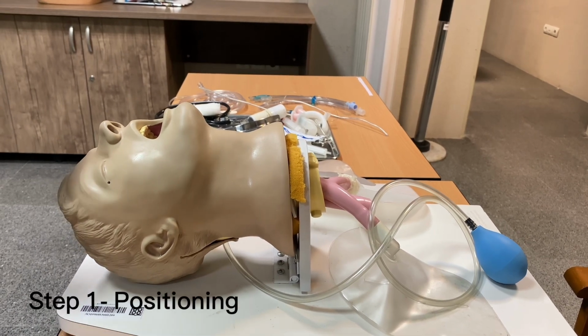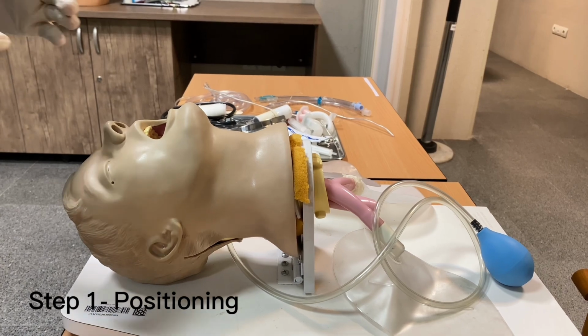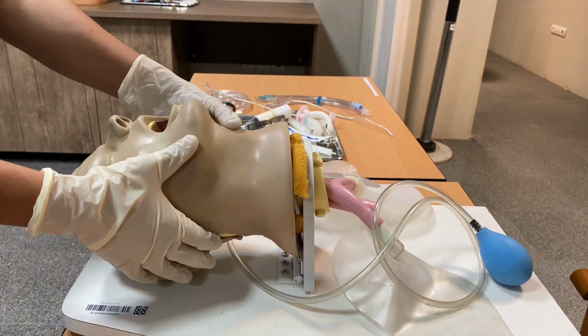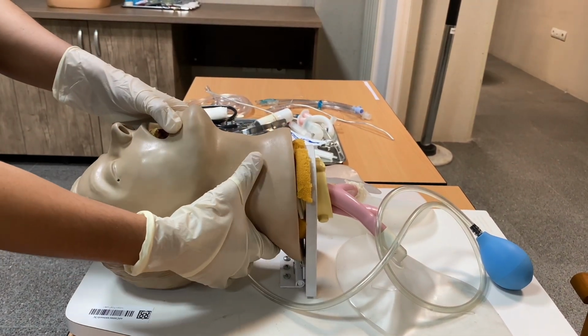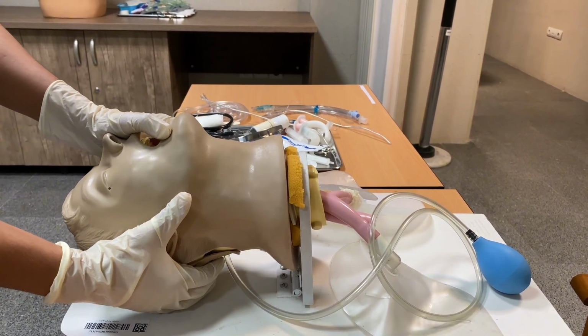Now we are going to start the procedure. The first step is to position the patient. The patient's head should be in the sniffing position, which means that the patient's lower cervical spine should be in flexion and the upper cervical spine should be in extension.